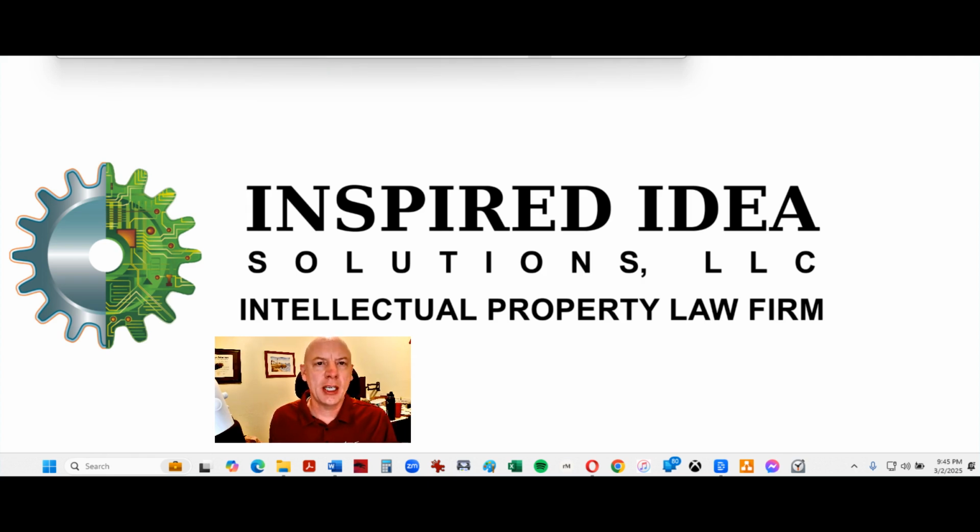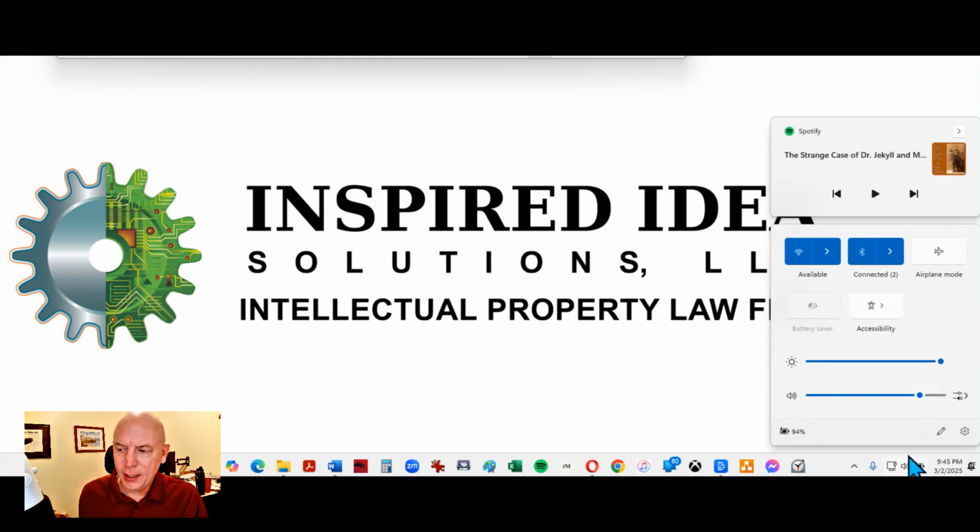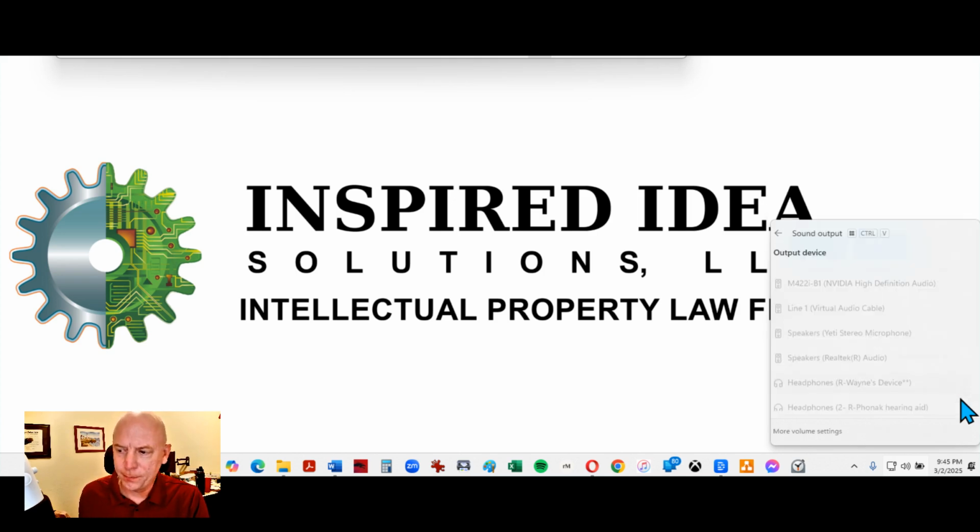One quick way to change the sound settings is to go down to the bottom right of your screen and click on the sound icon. Now it'll show you sound, a few other things. You want to come over here to this icon where you can select a sound output.